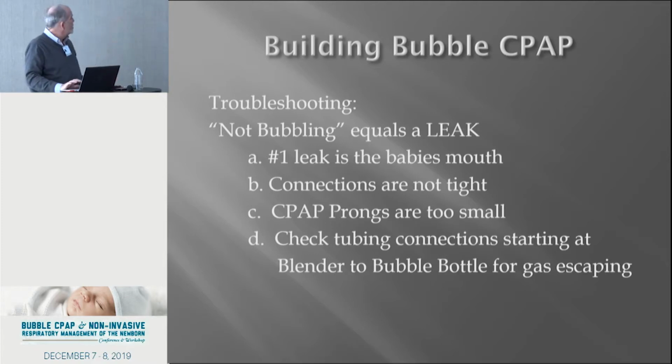Make sure all the connections are tight. Make sure that the prongs are not too small, okay? Like it can leak around here, okay? That's definitely possible. And run from the wall, making sure that there are no leaks. That generally will cover most of your issues.